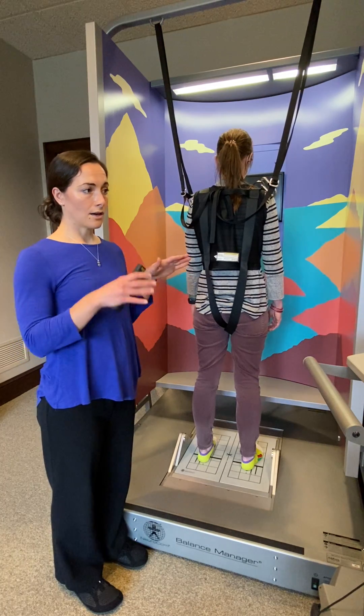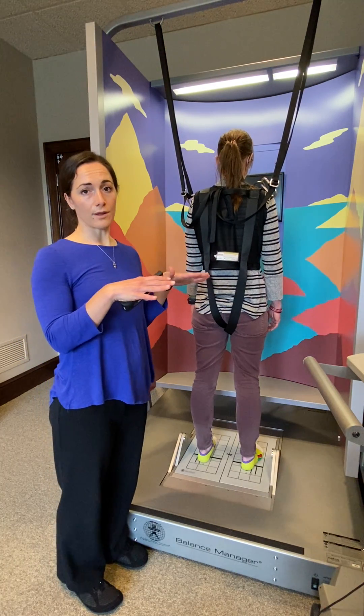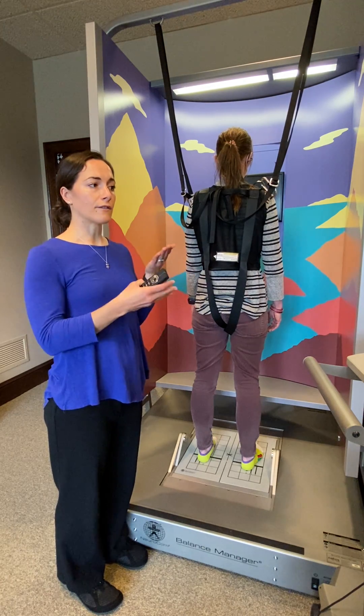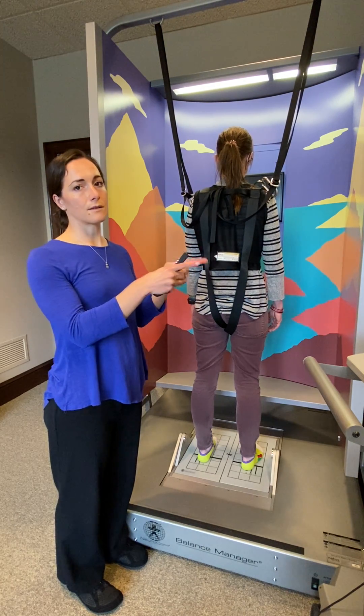What that tells us is, if you have peripheral neuropathy for instance, we'll be able to tell if that peripheral neuropathy is enough that it's going to affect your response to this kind of translation.